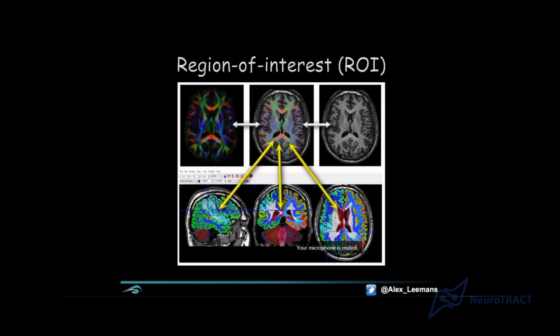Think of tract-based spatial statistics, this TBSS approach, or other voxel-wise analysis. I'm not a big fan of those. I did a lot of research in the olden days, and I realized that image registration, even in techniques like TBSS that try to alleviate some of these issues, I still think that the misalignment across subjects is a real problem, causing reliability issues. And so interpretation of the results is very difficult. But we can discuss this technique later.